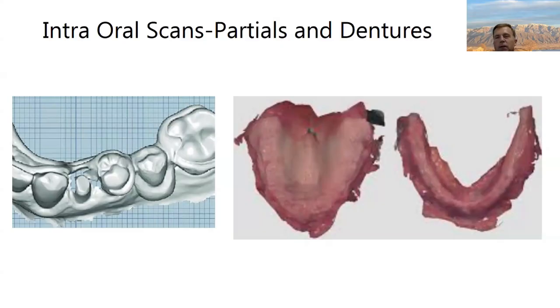Sometimes you might want to use a CBCT scan with the reference screw in place. And I realize I'm talking about things I haven't covered yet. So let's just say this. If you have edentulous patients and you're worried about potential file alignment, go over it with your laboratory ahead of time so that you can come up with an effective file alignment plan before we get going.